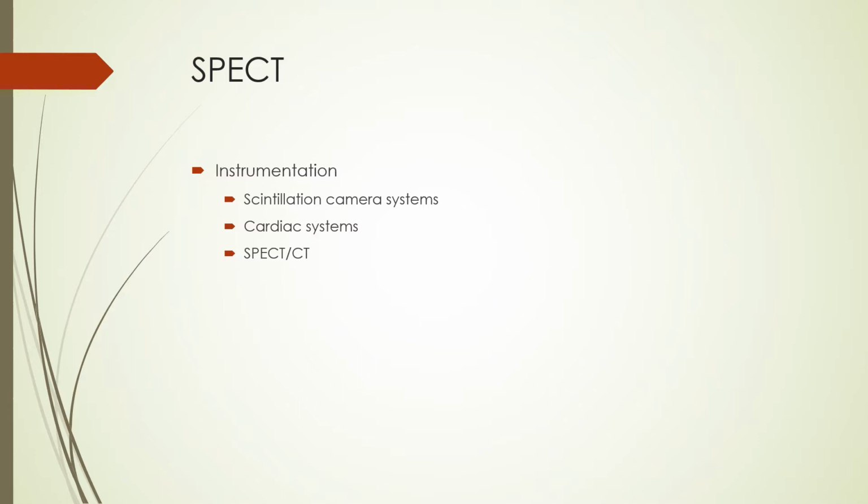When we perform emission computed tomography with individual or single gamma ray interactions in a crystal, it is called single photon emission computed tomography. When emission tomography is performed by detecting the annihilation interactions of photons released during positron decay, it is called positron emission tomography. We shall start with single photon emission tomography on the next slide.